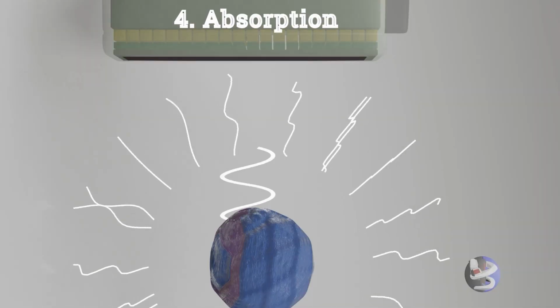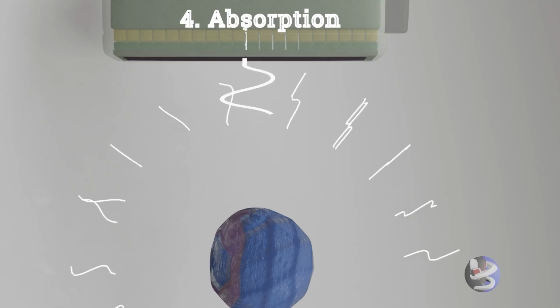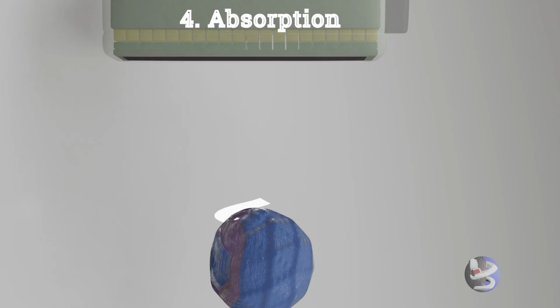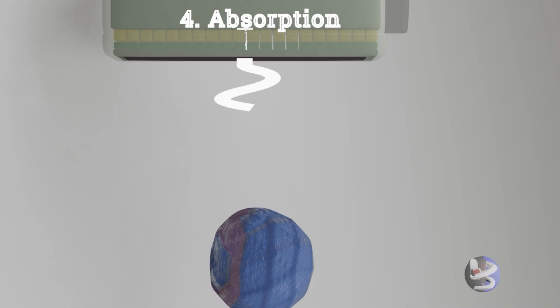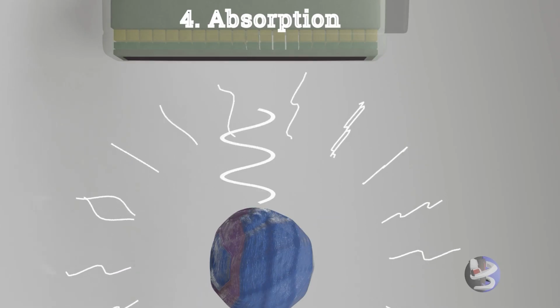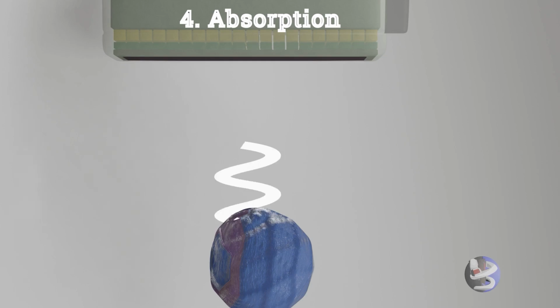Absorption. Absorption is the portion of the wave energy converted into heat energy. As the tissue can absorb energy to produce heat, an increase in temperature may occur. An increase in the power of the ultrasound beam will result in an increased potential for tissue heating. The smaller the scan area, the greater the energy passing through it. Strongly focused fields will produce particularly significant temperature increases.